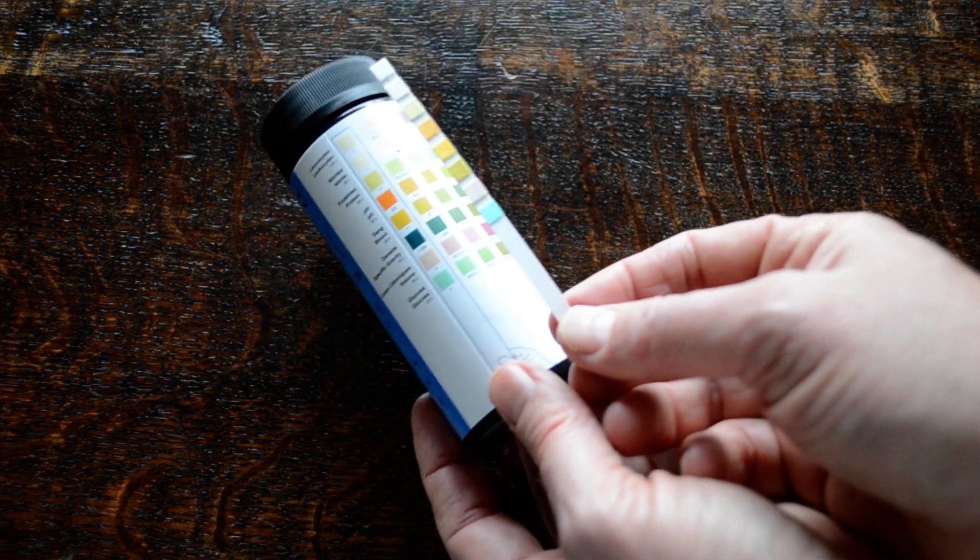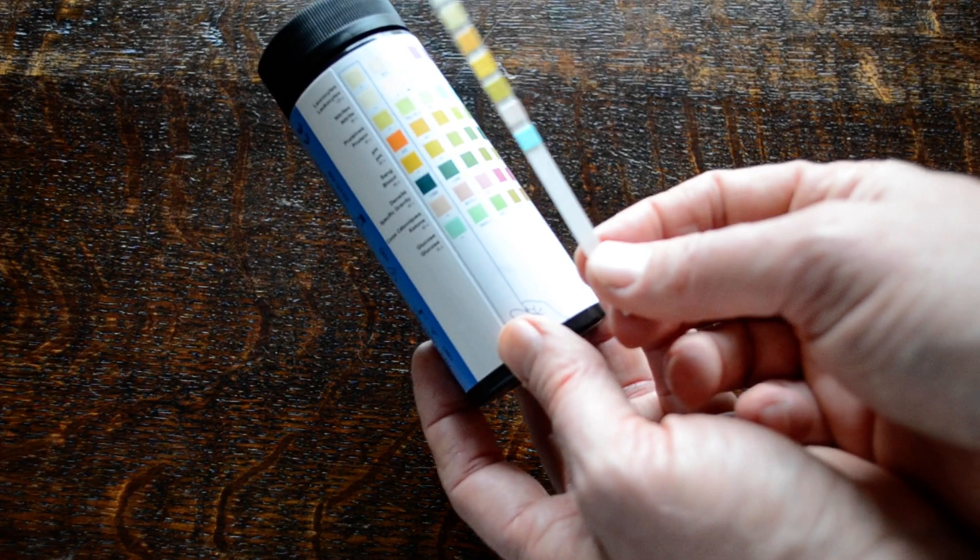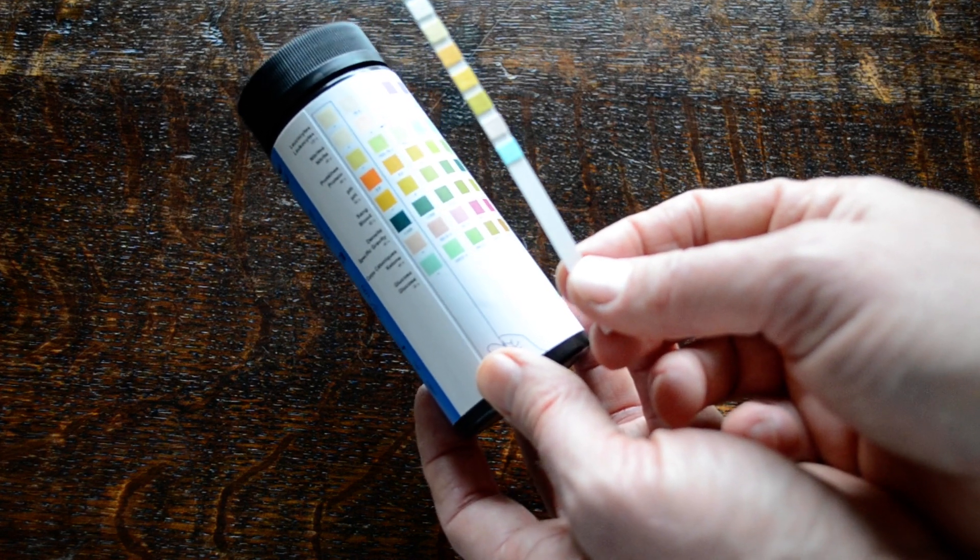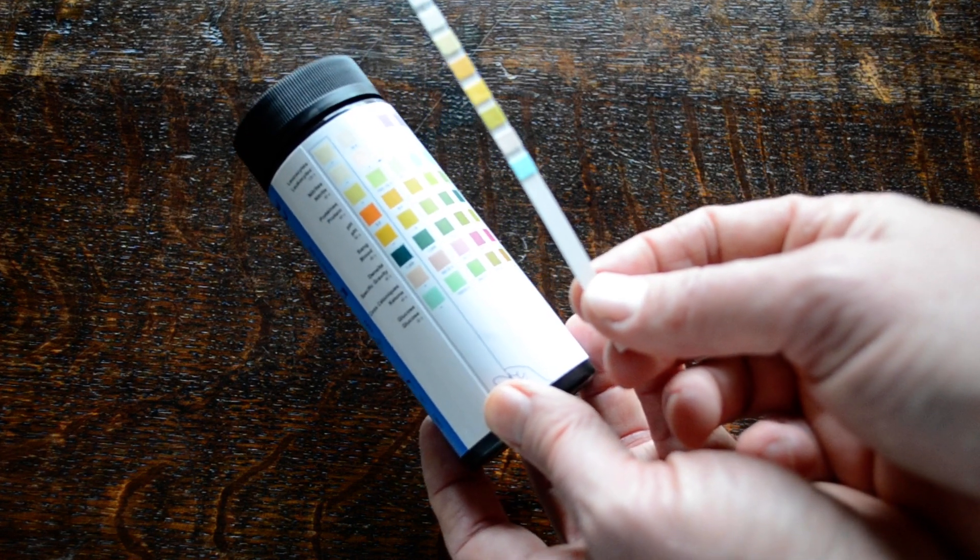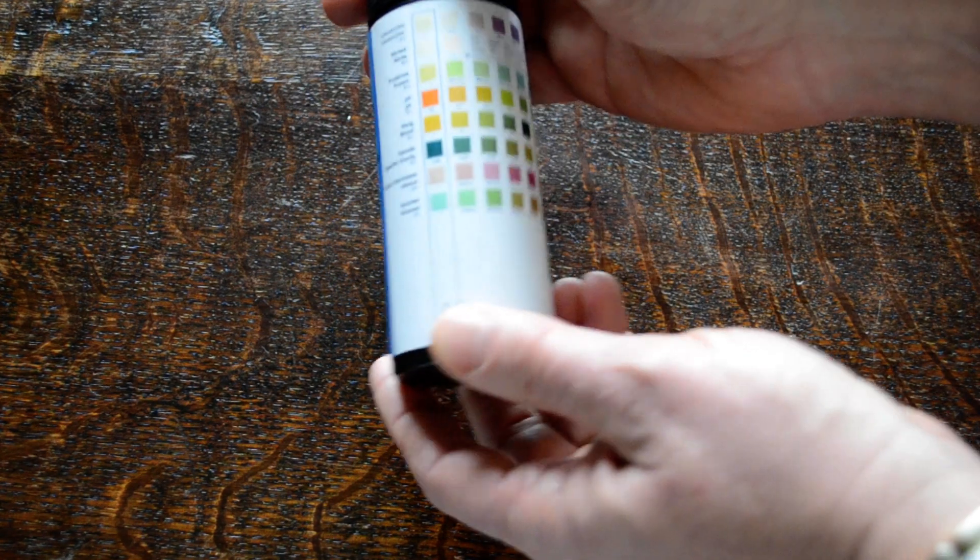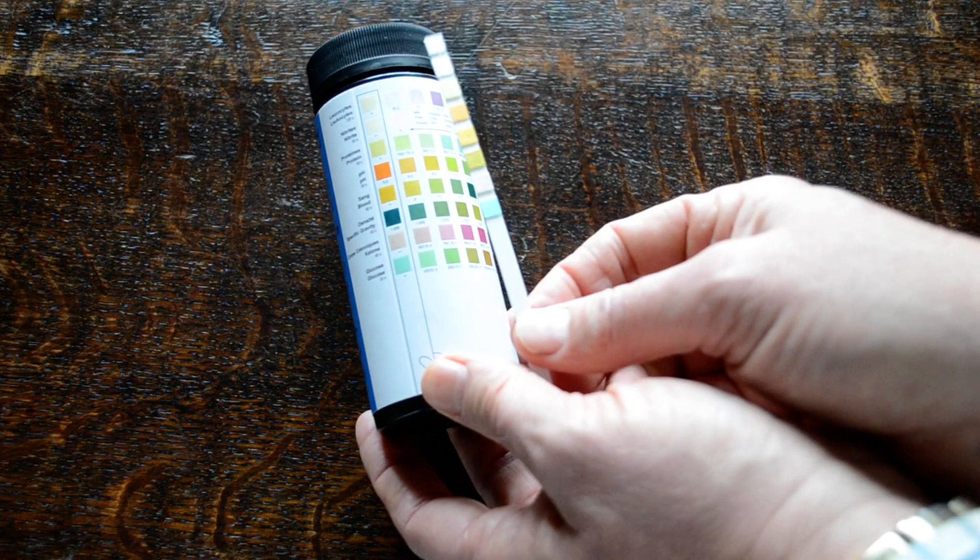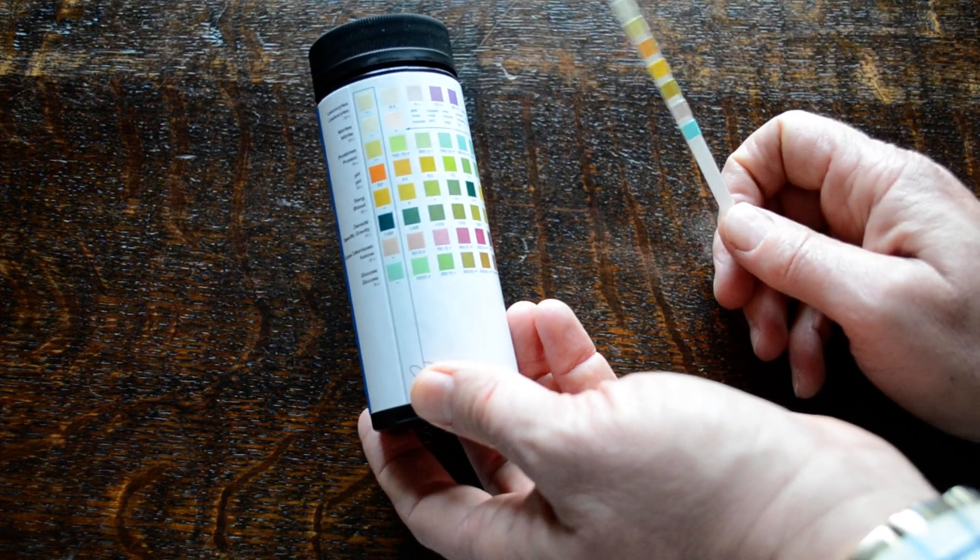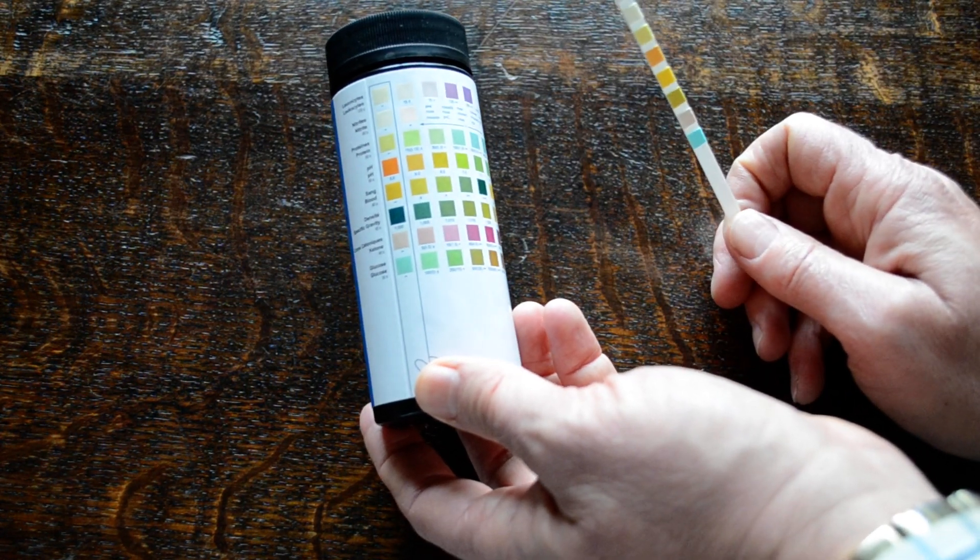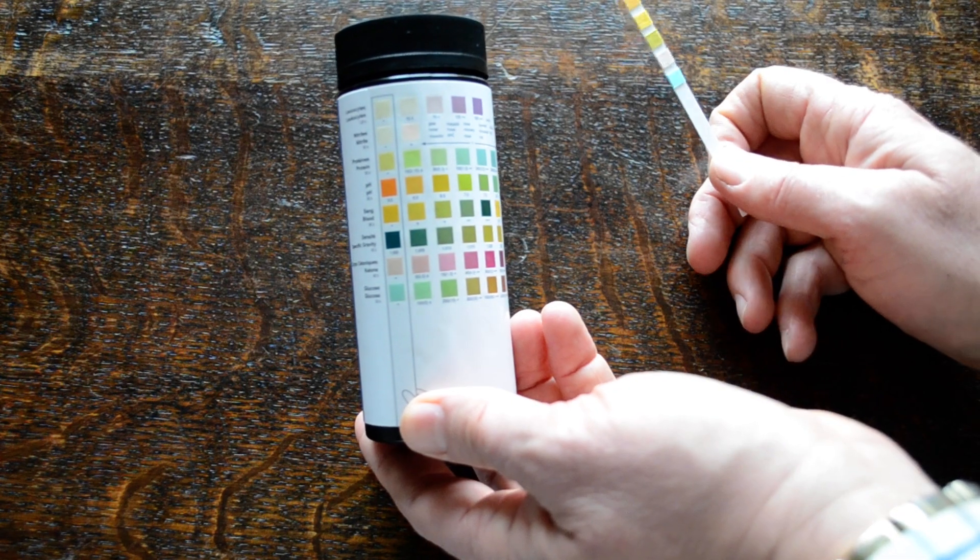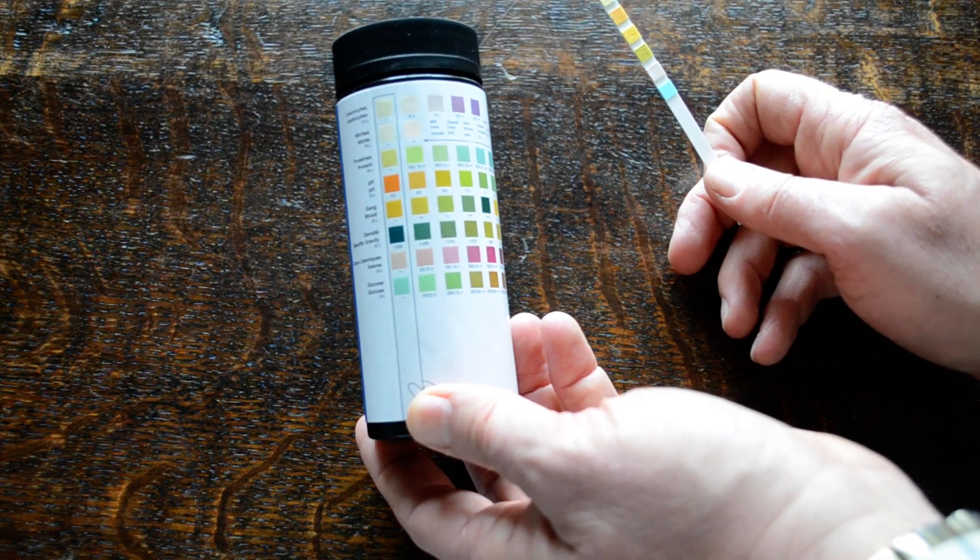Now it's important that when you've taken the test strip out, you check a few things before you're running your test. One is that you put the lid firmly back on to keep the tests in good condition. When these tests are first delivered to you, you'll find that there's a security seal inside that black lid. It's important that that is firmly applied and hasn't been perforated because that's what keeps them environmentally protected.